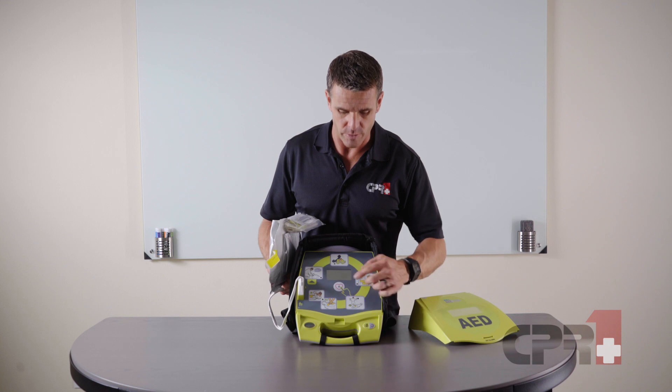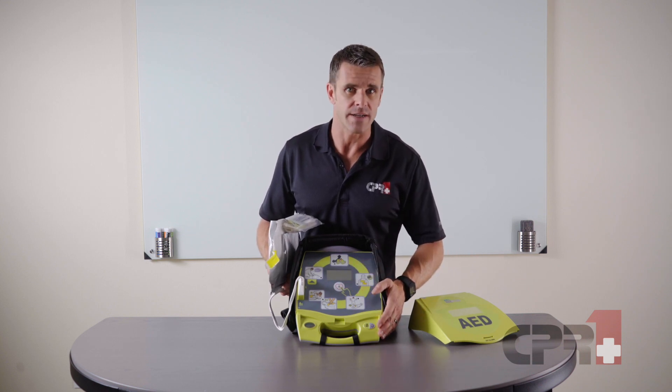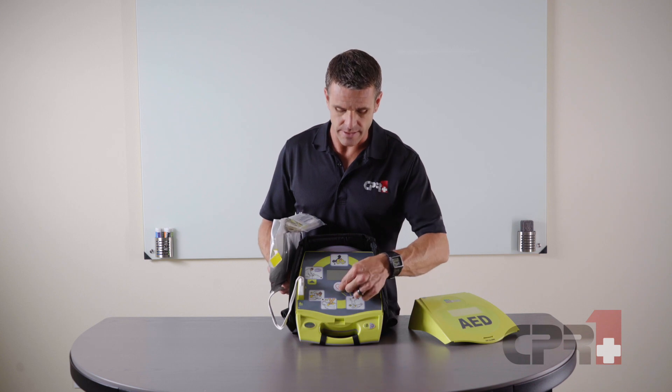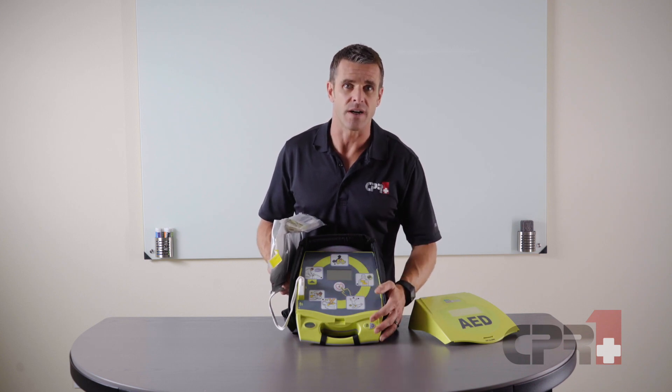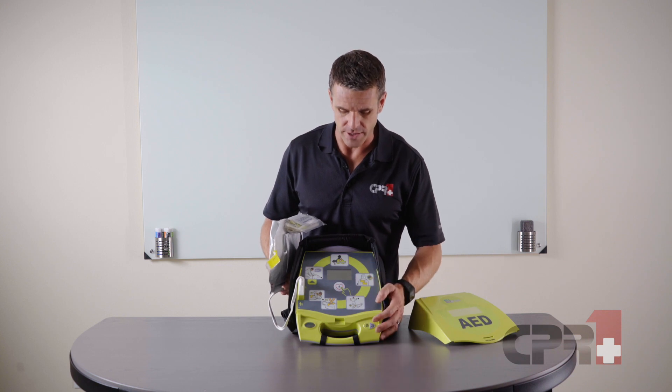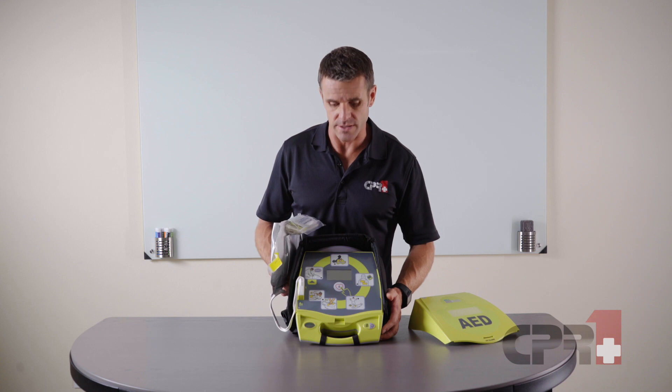With all AEDs, if we press the shock button at the wrong time there's no risk of accidentally shocking the patient, because this button is only activated when the AED has sensed a shockable rhythm. Being that it's semi-automated, we do have to press that button to deliver the shock.